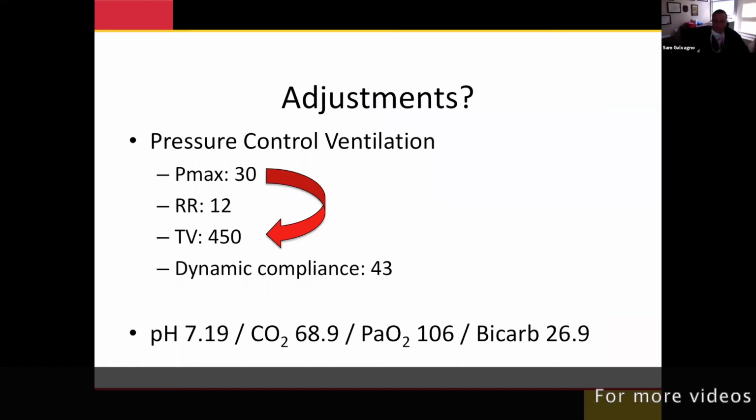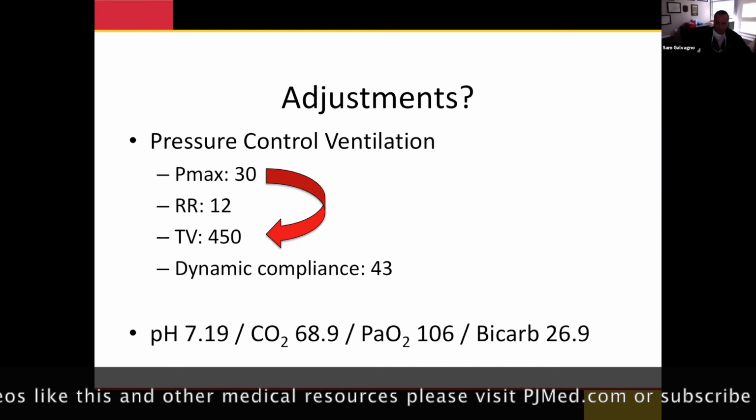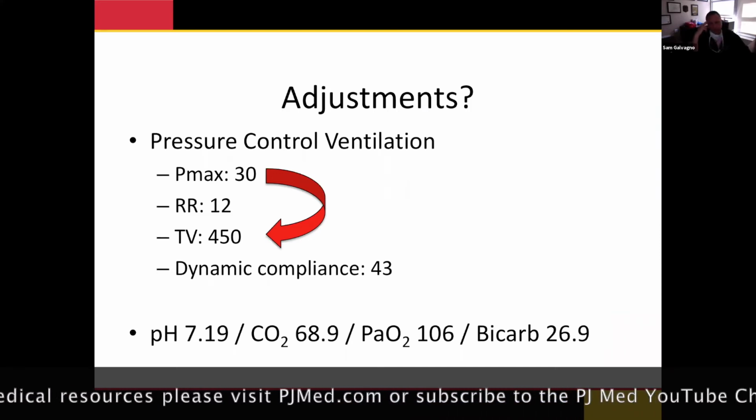They did not choose assist control. They chose pressure control. So as a reminder, can anyone explain what that means? What's pressure control mean compared to assist control? Any thoughts?